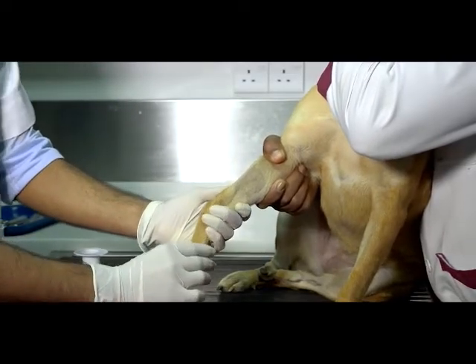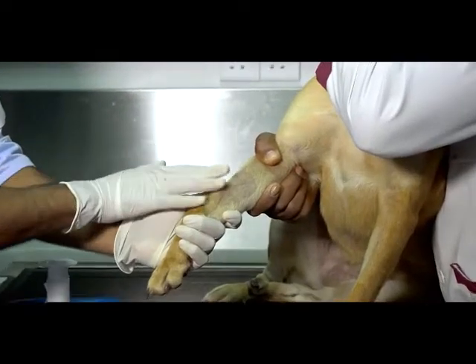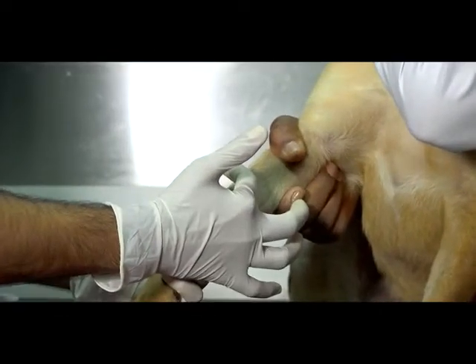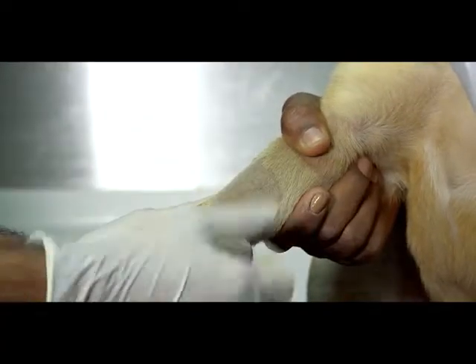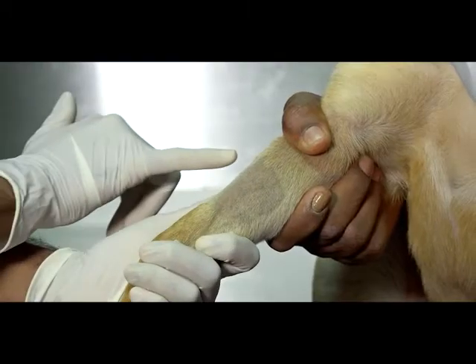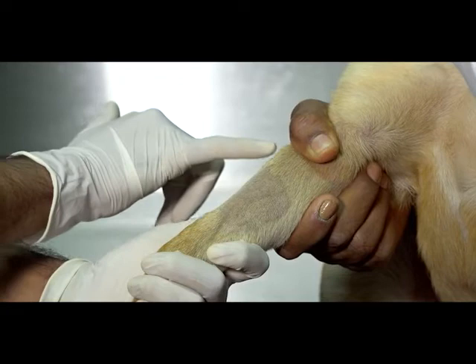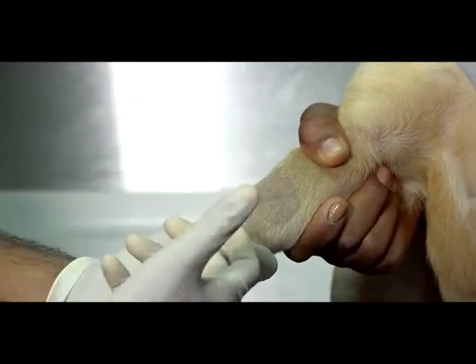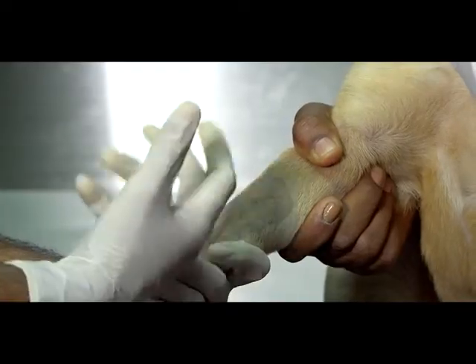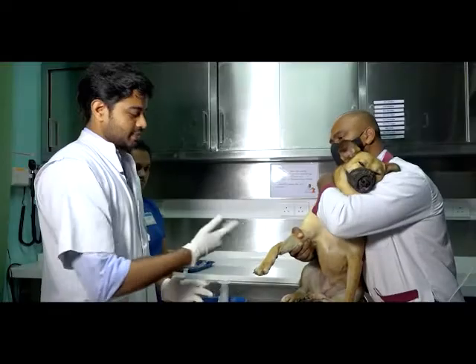Now if you could have a closer look, you could see we've arrested the vein proximal to the site where we are going to place the IV catheter, and you can see the bulging of the cephalic vein over here. So that bulging of the cephalic vein facilitates us to place the IV catheter easily, and it makes the vein more prominent. So we're going to place the IV catheter.